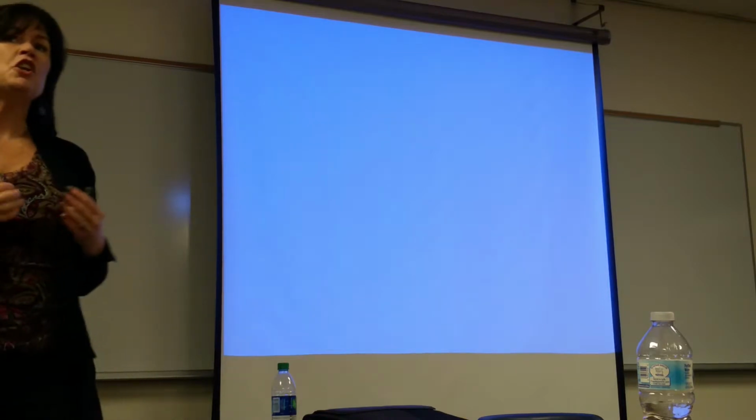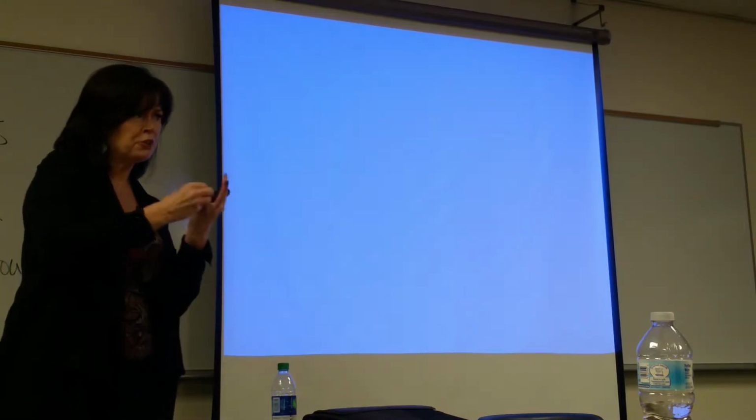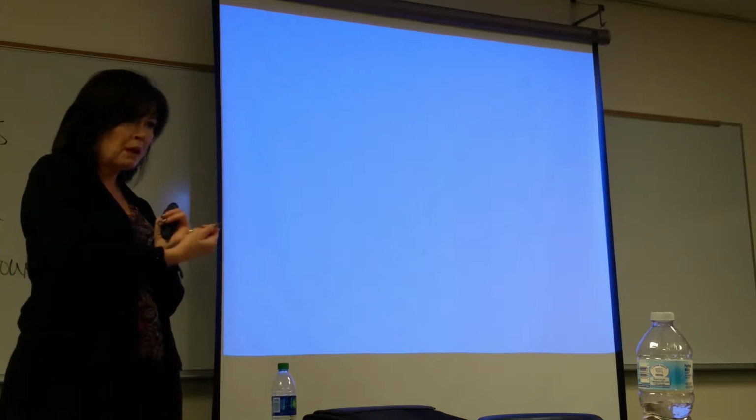So if you have knowledge about those two, the top two reasons why a female will not get a mammogram, if you can talk to that person and explain about the compression, explain about findings, then they're apt to have one done. Okay, so that's, I think, the most important thing, and I'm going to address those when we go through this lecture.